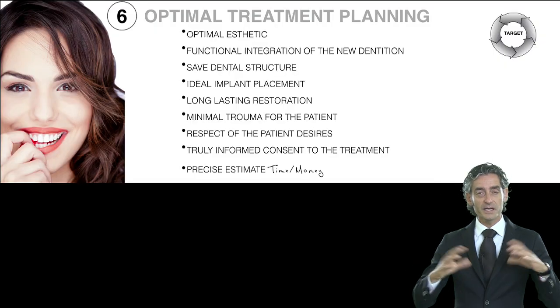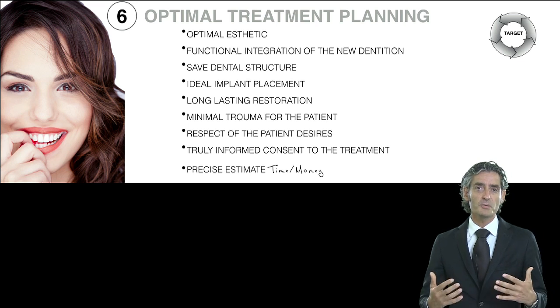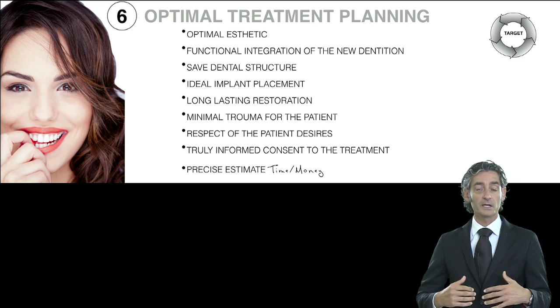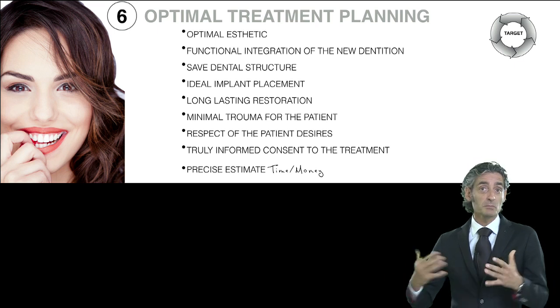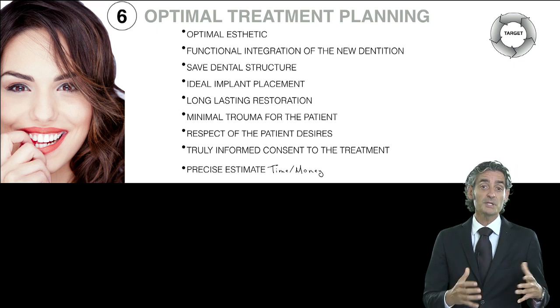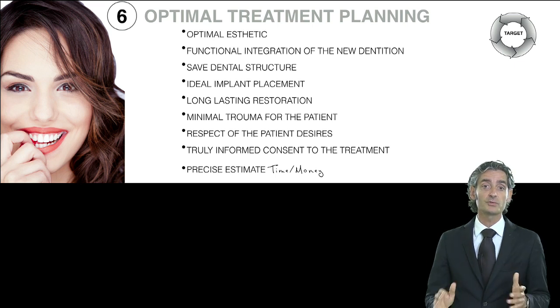And so at the end of all this evaluation, we can arrive at the optimal treatment planning. So for us, the optimal treatment planning in this case has evaluated the aesthetic, the function, the ideal implant placement. We are looking at long-lasting restoration, minimal trauma for the patient, and for sure a truly informed consent to the treatment, through the use of the previsualization. Much more, we will be really precise in our estimate of time and money. For us, it's important, and also for our patient.